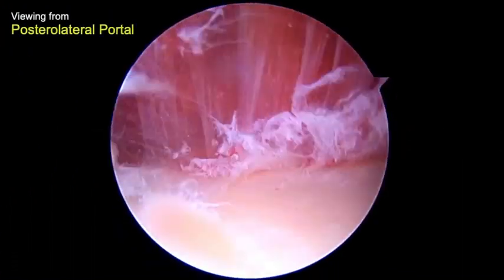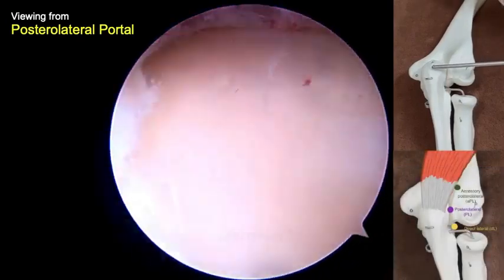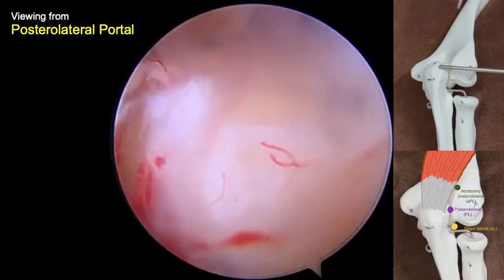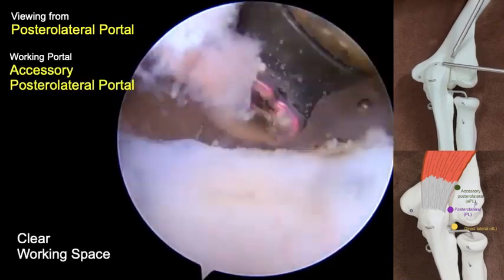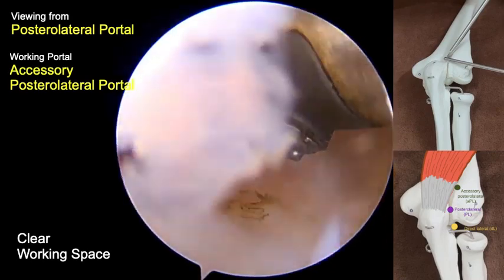Proceeding to the posterior compartment for debridement of the posterolateral plica, a posterolateral portal was created as the initial viewing portal. Next, an accessory posterolateral portal was created as the working portal, which was 2–3 cm proximal to the posterolateral portal.